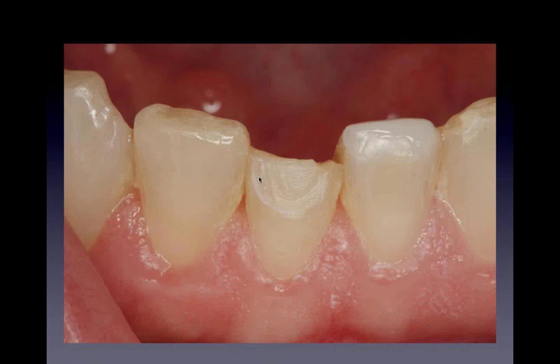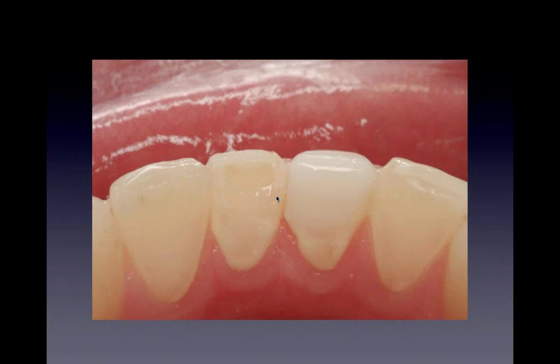I have a very, very thin margin here, and then again on the lingual. So I'm basically wrapping around the lingual and the facial with the composite instead of just adding an incisal edge, as you see here. This was done a while back with my partner. It's kind of surviving, but it's chipping on the lingual, it's chipping around. So I kind of bring it down and get a semilunar preparation. Here's the lingual preparation down here. It's actually a little bit more aggressive because I want it to sit there on a nice butt joint margin.